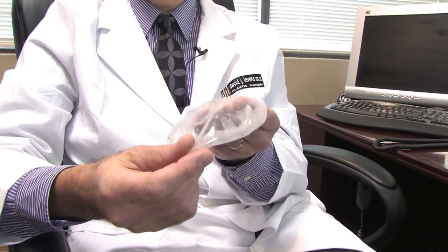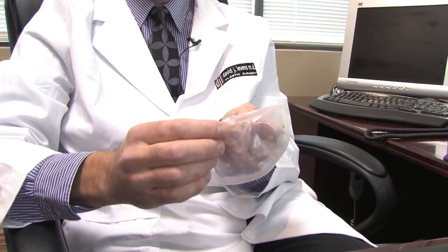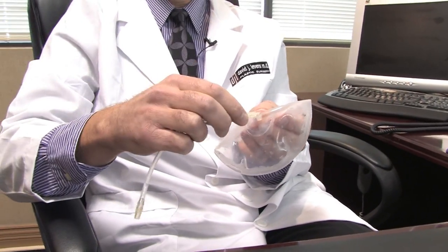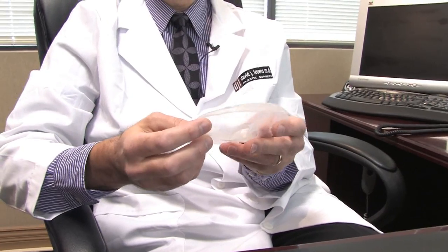The saline implant comes collapsed, as you see here. There's a self-sealing valve, which is filled up at the time of surgery with the saline.